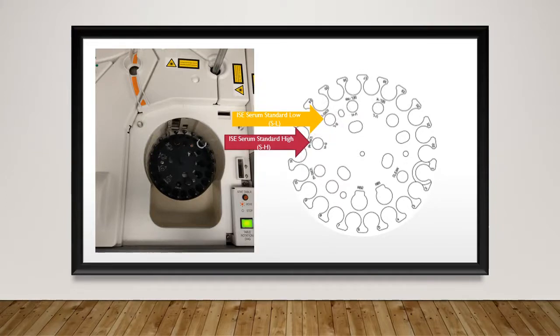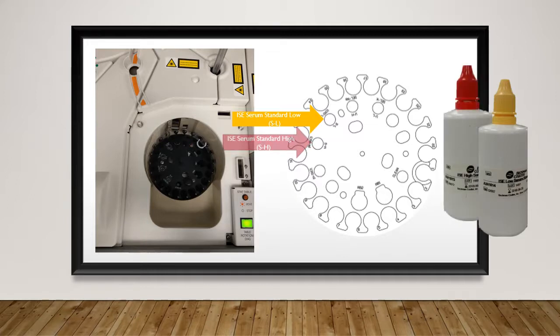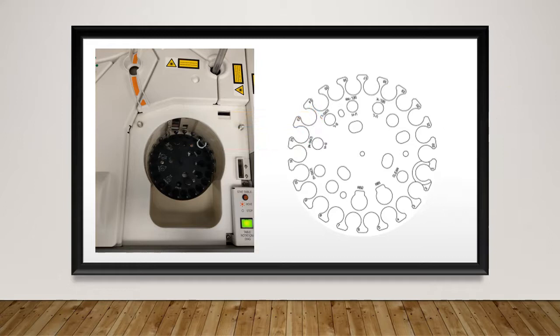Fill a Hitachi cup with low serum calibrator using the yellow top serum low calibrator bottle and insert it into the SL slot. Fill another Hitachi cup with high serum calibrator using the red top serum high calibrator bottle and insert this into the SH slot. Now close the stat cover and uncheck the analyzer maintenance box to put the analyzer back into standby once the prime has completed.